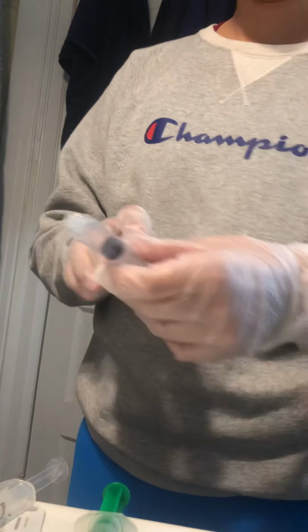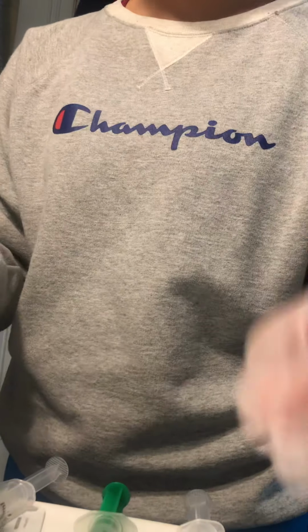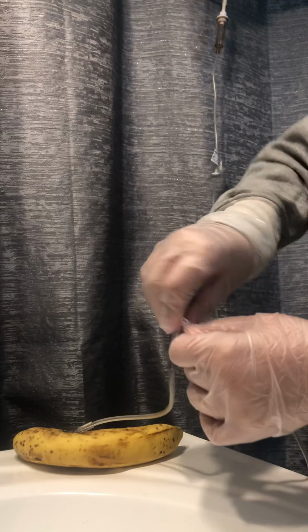Okay. So we're going to do the lower port. We're going to take another alcohol swab and clean the lower port with alcohol.